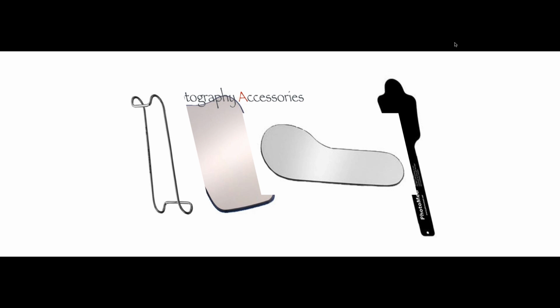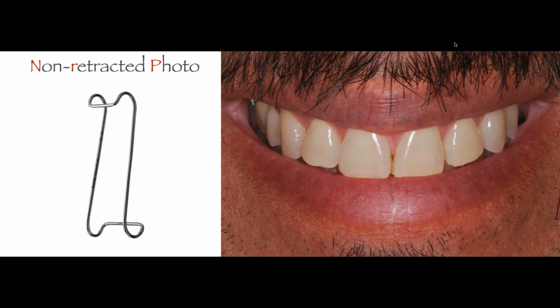Now, that lateral mirror is not only used for lateral shots, it's used as well for occlusal shots when you want to take quadrant shots and not the full arch photo. For the full arch photo, you will use the occlusal mirror. But for segmental or quadrant photos, you will use the lateral mirror for the occlusal view. And we're going to show you here every single step you need to take to achieve high quality photos.